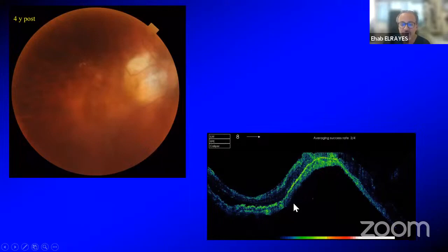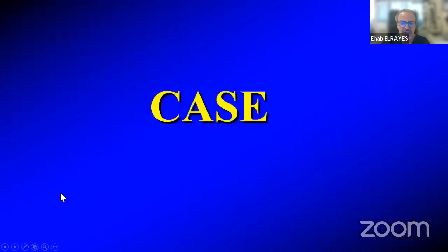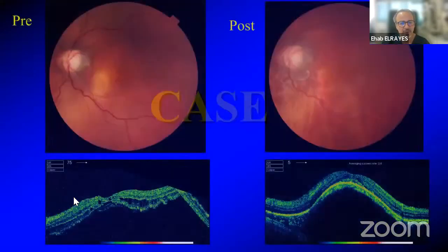14 months. But we found that if you separate or sever the choroid from the sclera, or remove the septa that connects the choroid to the sclera in an area of staphyloma, the choroid tends to stick to the retina. It never goes back again. And that's why after 4 years, you still have that choroidal indentation. And we've been following up for more than 10 years. These holes never open because you bypass the pathology. And even if scleral elongation happens, it happens behind the area that was already buckled before.